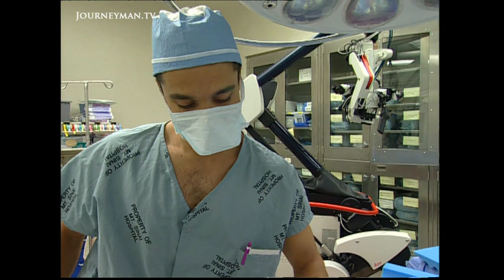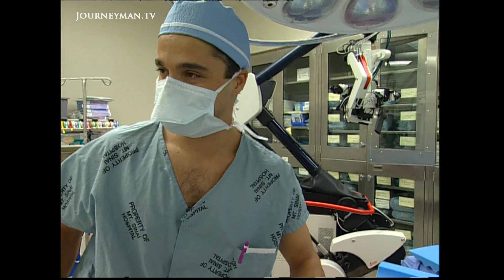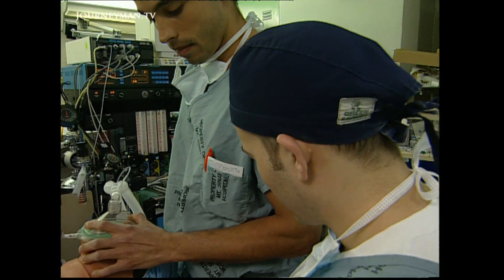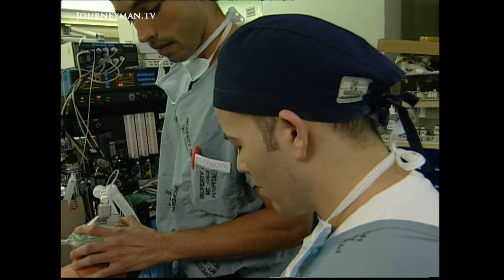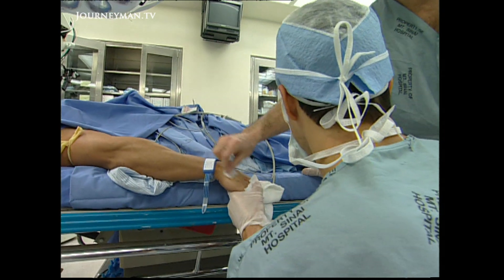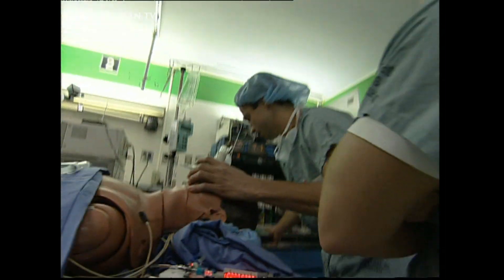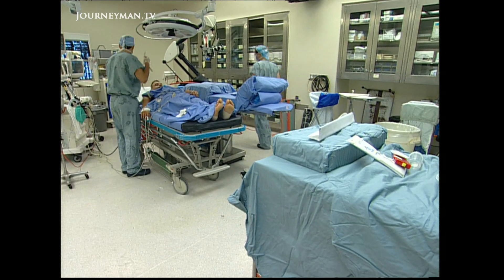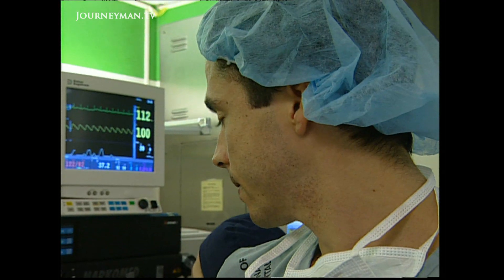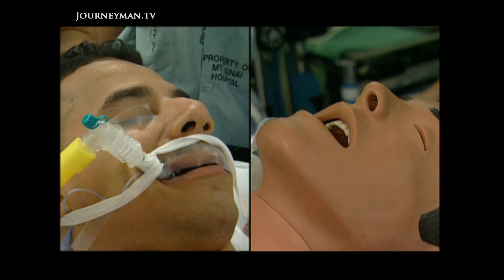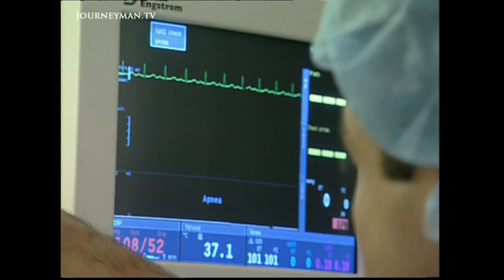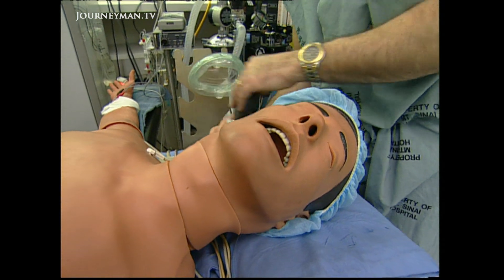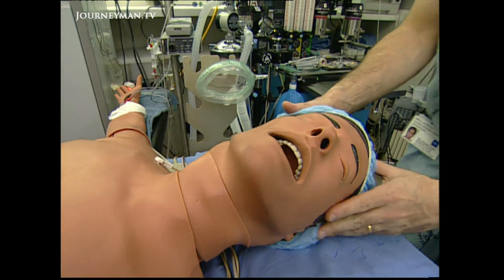Dr. Bernard Baez is a first-year anesthesiology student at the Mount Sinai Teaching Hospital in New York. Today he has two patients — both male, 20 to 30-ish, and usually fairly healthy. But one of his patients will die. Fortunately for Dr. Baez, that patient is Hal, a human simulator.